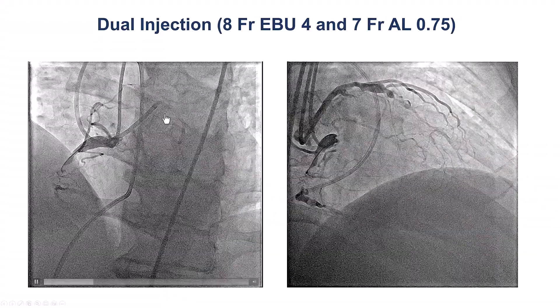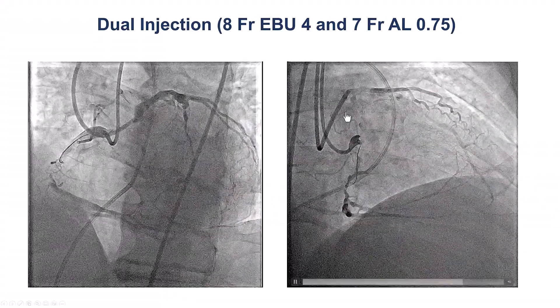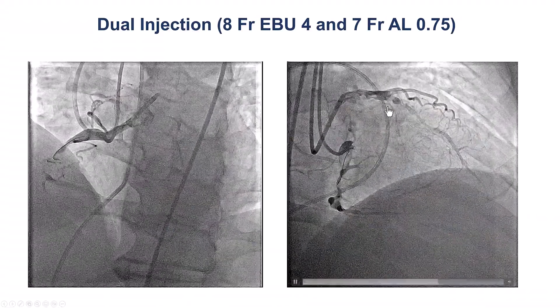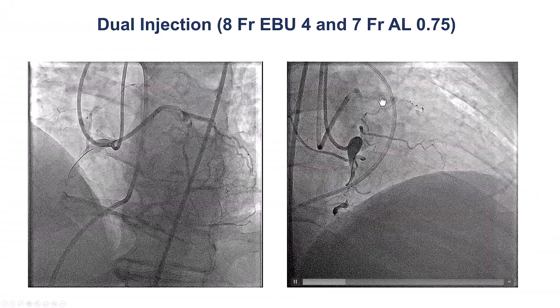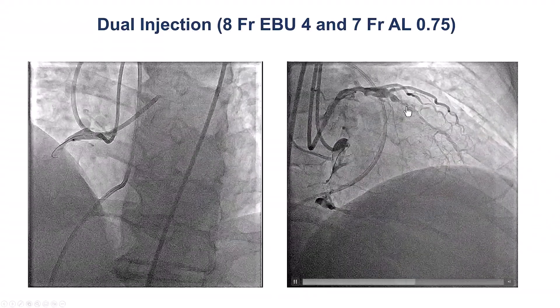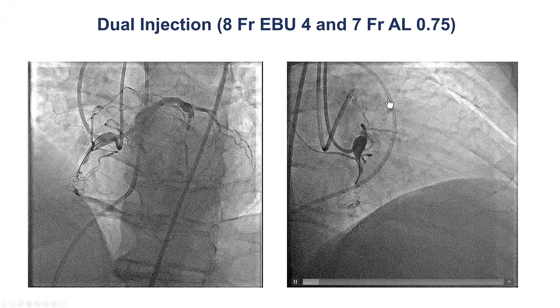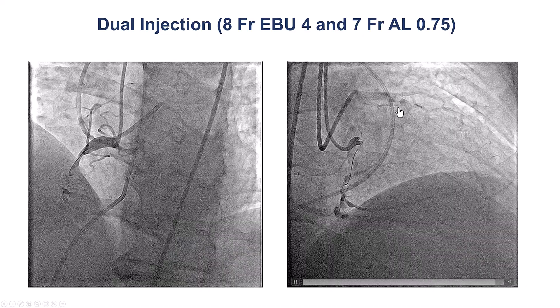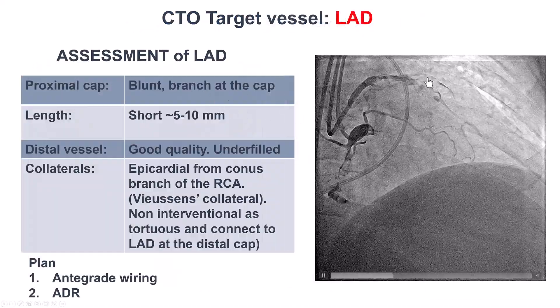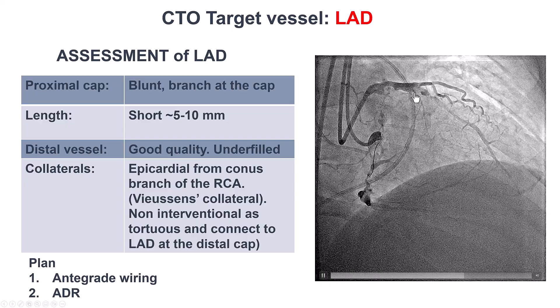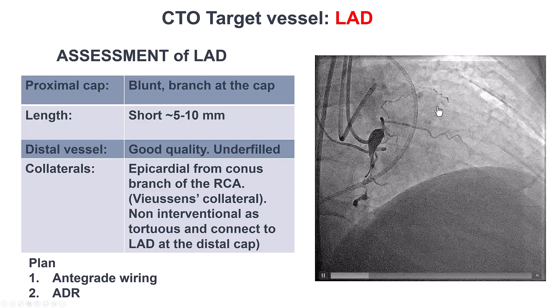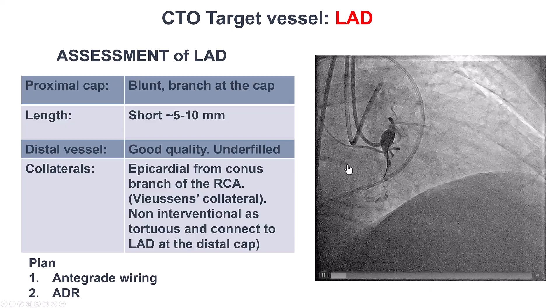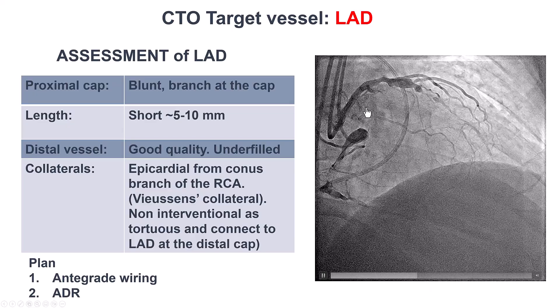This is the dual injection, injecting from the right coronary artery as well as the left main. We have femoral-radial access. On the dual injection, the LAD is a very favorable CTO — a very short occlusion. There seems to be some tapering of the proximal vessel and some distal disease, but the length is very short. We have a relatively blunt entry, but there may be a microchannel there. The distal vessel is of good quality, although there is some disease.